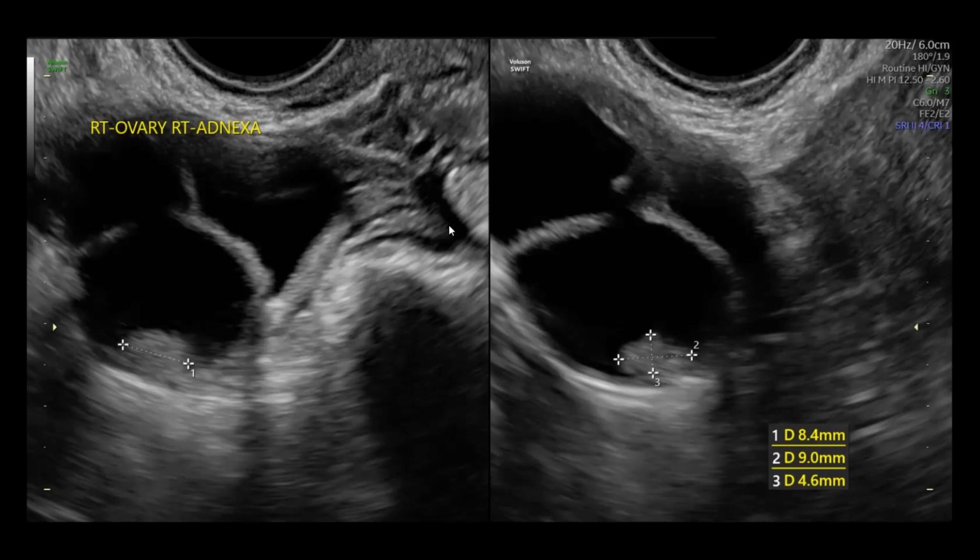The cutoff for a papillary projection is 3 or more millimeters. So this meets the criteria for a papillary projection. And in this particular capture, I'm not just looking at the size. I'm also looking at whether there is the casting of an acoustic shadow beyond this papillary projection. In this region right here, the sound waves are traveling through, and I'm looking for acoustic shadows right here. Now, acoustic shadows can be quite difficult, sometimes quite subjective, but in this particular scenario, I'm not seeing any.